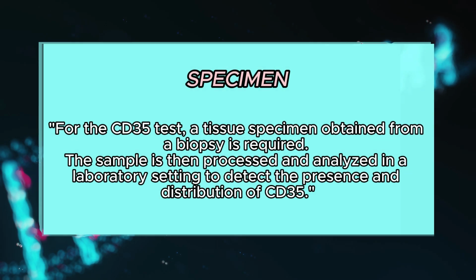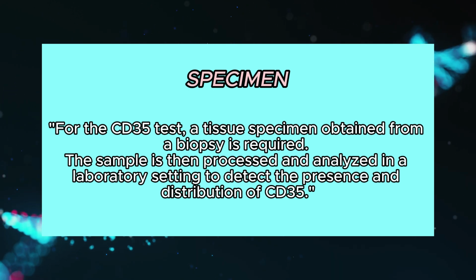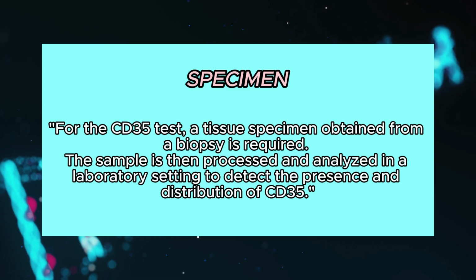Specimen used. For the CD35 test, a tissue specimen obtained from a biopsy is required. The sample is then processed and analyzed in a laboratory setting to detect the presence and distribution of CD35.